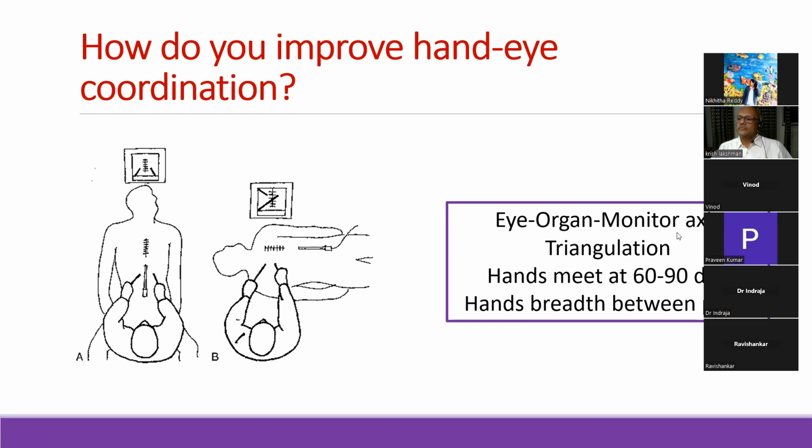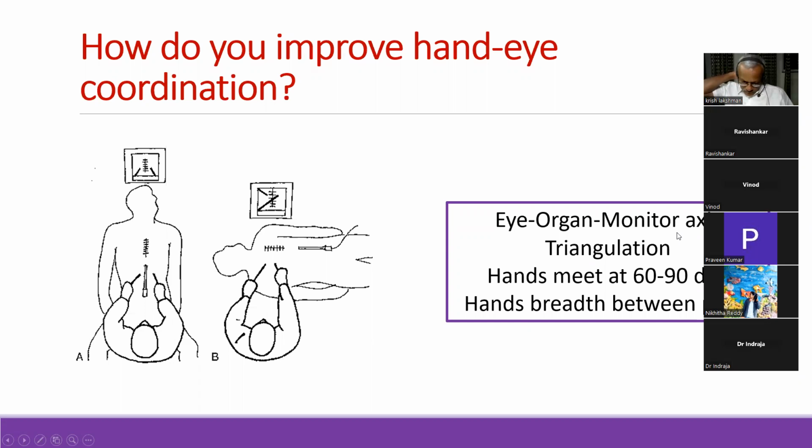Sir, does the height of the operating table make a difference in the hand-eye coordination, sir? No, it makes a difference for the ergonomics, and we'll talk about it later.